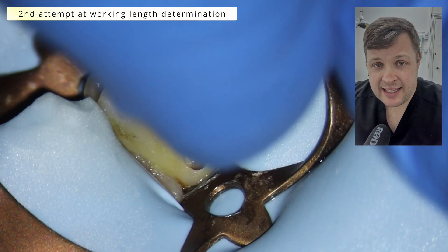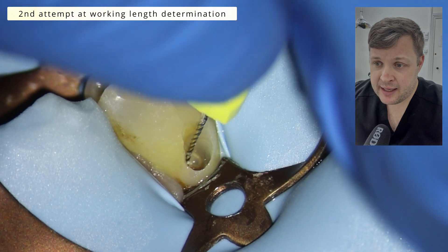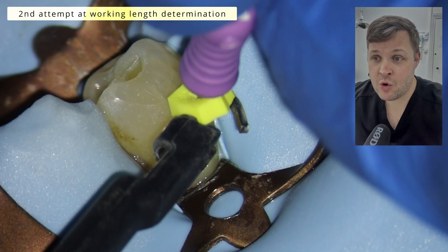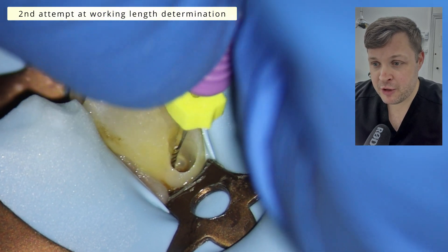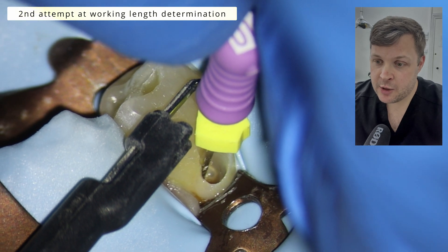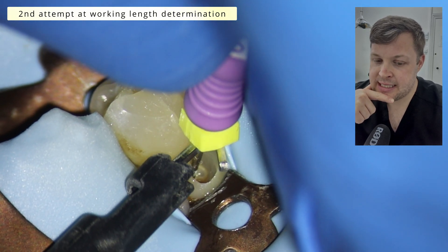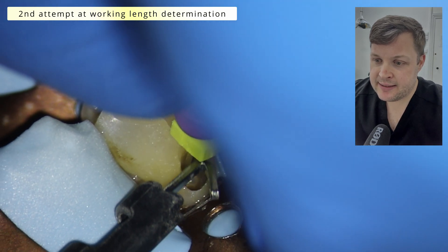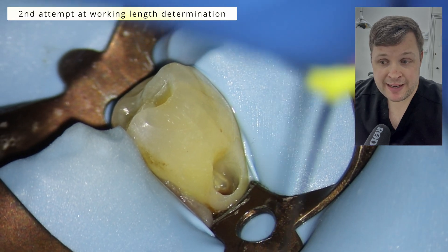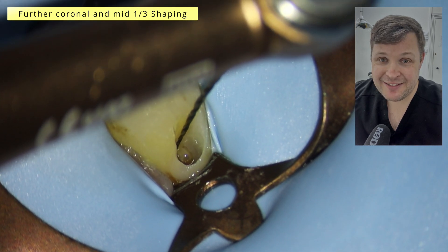I'm going to take a second attempt at working length determination with the size 10 K-file to try and reach the apex. This time the hand file reaches a little bit further, but it doesn't quite get that zero reading on the apex locator. I'm doing a little bit of watch-winding but it's really tough. I'm thinking maybe the apex is quite complex, so I need to back off — try not to push too far because you might ledge or, more importantly, fracture the file.